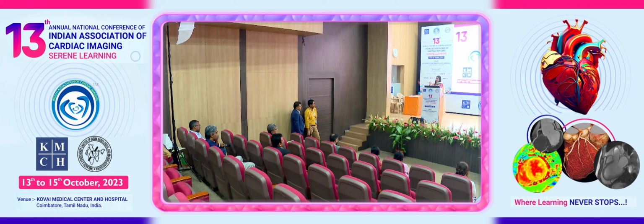When we did that, we also realized that the cardiologists are asking us to do CT-FFR. We are telling them there is ischemia or no ischemia. Even in patients where we have said ischemia, they triage them again, so they don't take them for revascularization. So we went back and said, please triage them. Just send those patients where, if we say something, you are going to act on it. So that was one part.